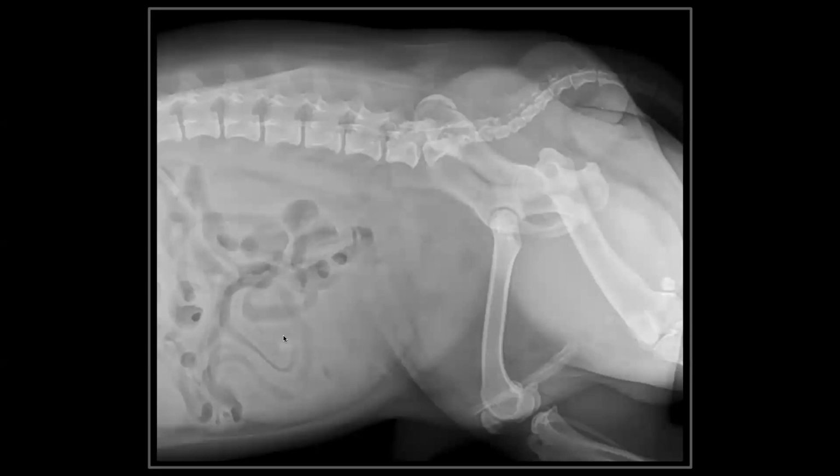If you look on this patient, just caudal to the os penis is a density consistent with urolithiasis. This is a urethral stone. So this patient has a urethral stone, likely with secondary, some degree of obstruction and enlargement of the bladder. In the future, once everybody settles with the system, we'll automatically pick up urethral stones as well.